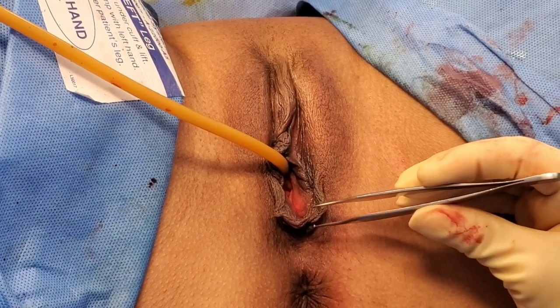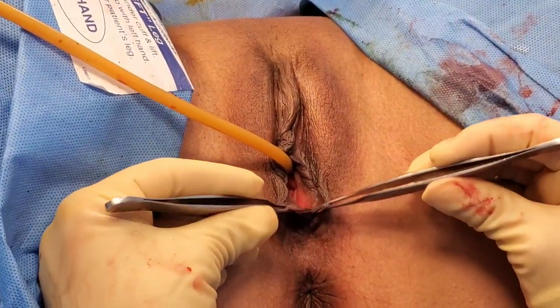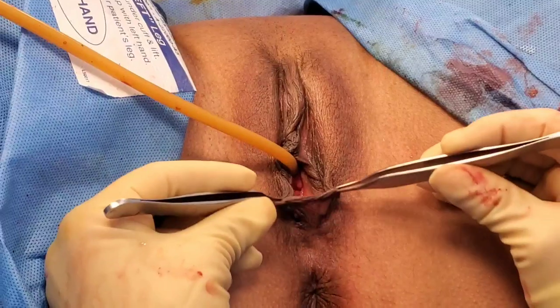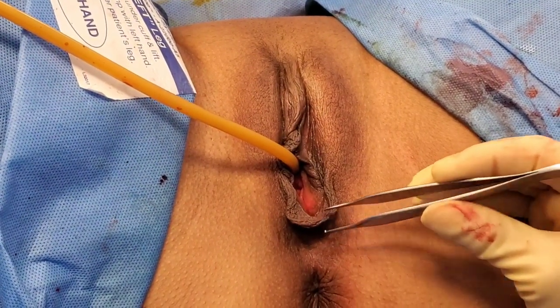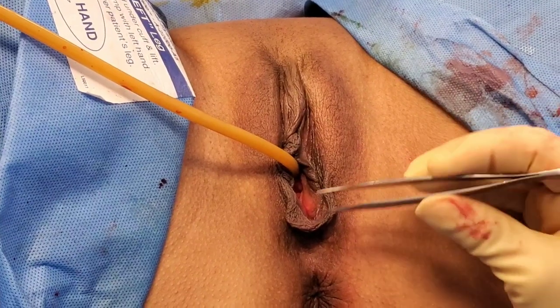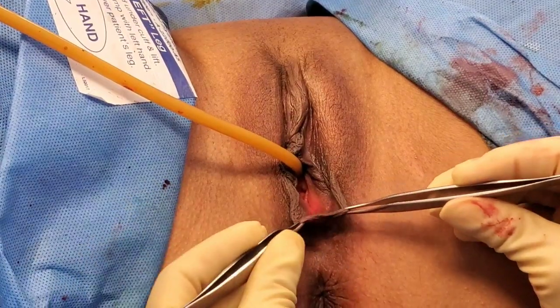Today we're doing a labiaplasty for this patient. She had children and you can see they left a lot of redundant tissue here at the perineum. This really bothers her every time she works out or rides a bike. So we're fixing this excess tissue so that we make it nice and flat.